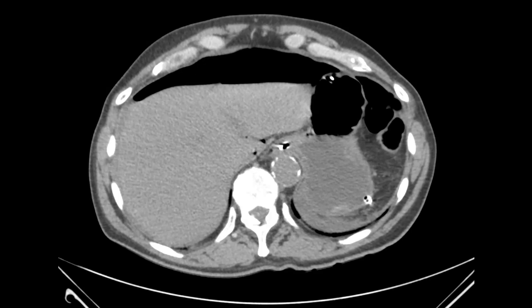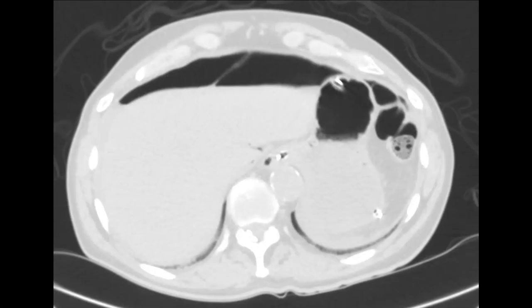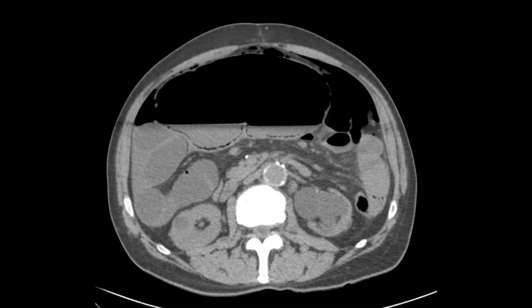Let's look at the axial view. On an axial soft tissue window, we see the free air, but we see it much more extensively when we look at the lung window. We also see that falciform ligament outlined as well as a few foci of gas deep to the liver. Returning to the soft tissue window, we see again that dilated cecum with curvilinear gas within the wall indicating pneumatosis.